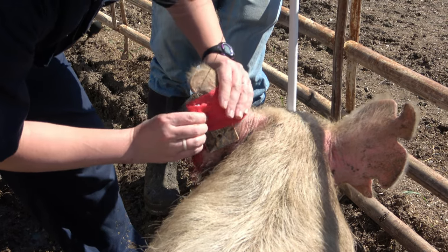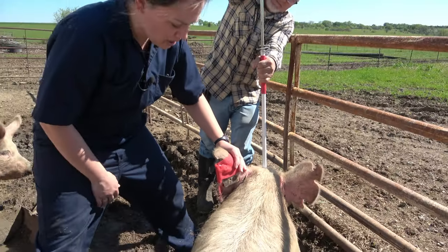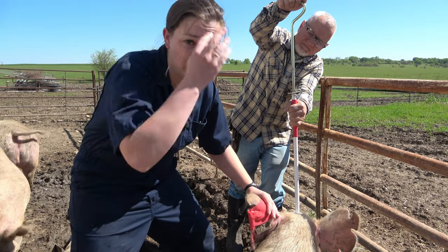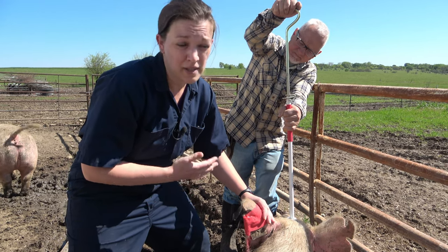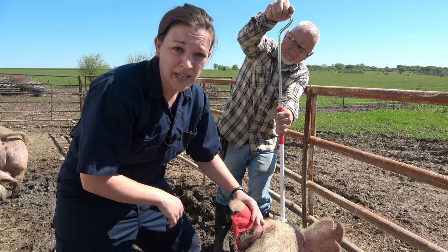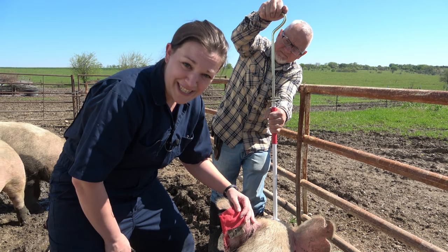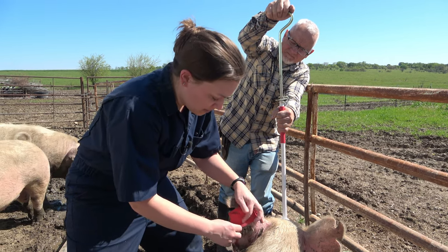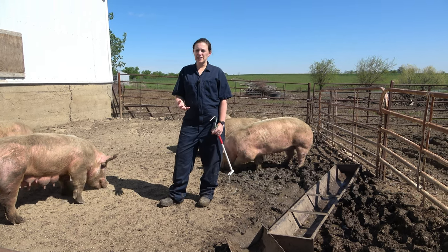All right. So now we have our IV catheter in place on our pig here in her ear. You do always want to make sure that you flush any catheter before you put any drugs through it, because some things are not meant to go under the skin. Some things can burn under the skin. So definitely make sure you flush. We're not going to pester this sow anymore today since she is awake and she's been halfway decent so far. So we'll go ahead and let her go and get this catheter out. So that wraps us up for today, guys, for IV catheterization in pigs.